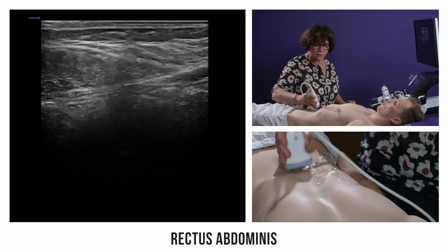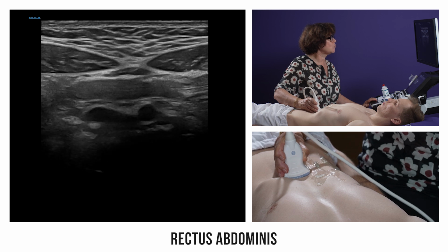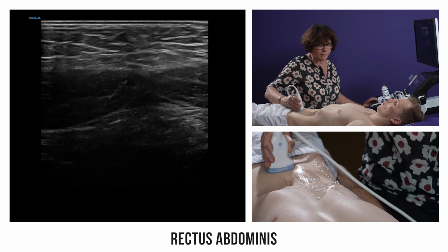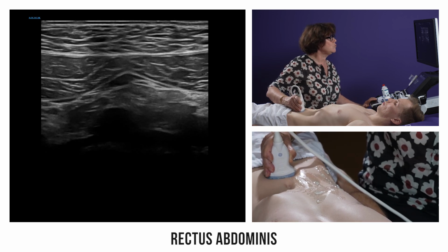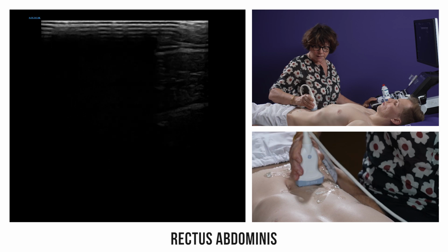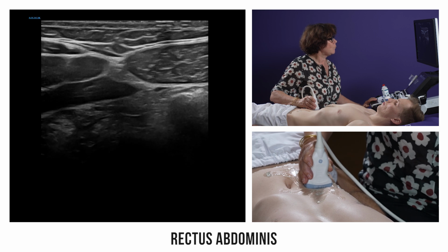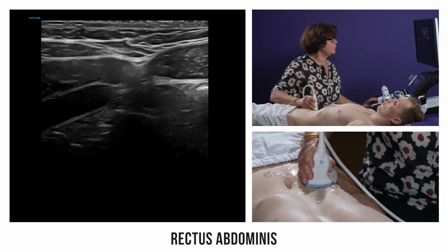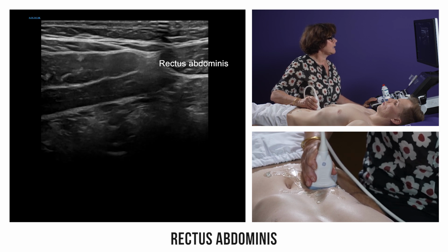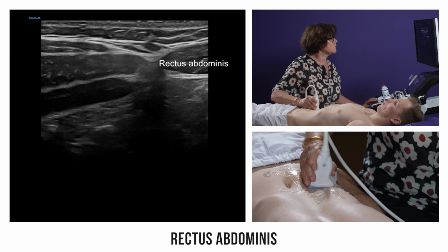In an axial transverse view just above the umbilicus, the linea alba separates the two rectus abdominis muscles and appears relatively wide. However, below the umbilicus, the two rectus muscles are very close together, and the linea alba becomes virtually invisible. Laterally, we see the lateral border of the right rectus abdominis, and a fibrous line separating the rectus from the anterolateral abdominal muscles. This is the linea semilunaris, or Spiegel's line.